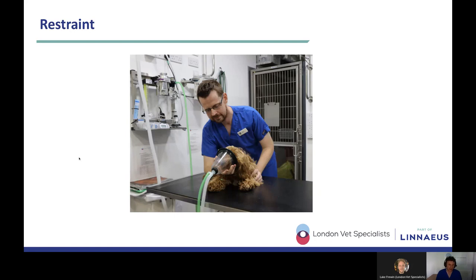My advice would be that most patients, the vast majority of patients, are going to need some degree of sedation in order to do a complete, accurate, comprehensive ultrasound exam. Some patients you can do conscious, but the vast majority are going to need something just to take the edge off, just to make sure that they'll tolerate lying still for a good half an hour and you poking at their abdomen, getting all those images that you need.